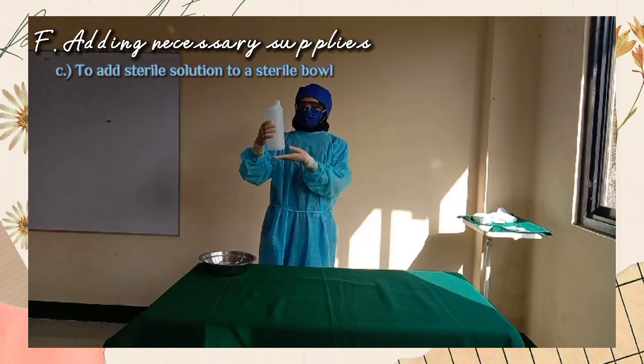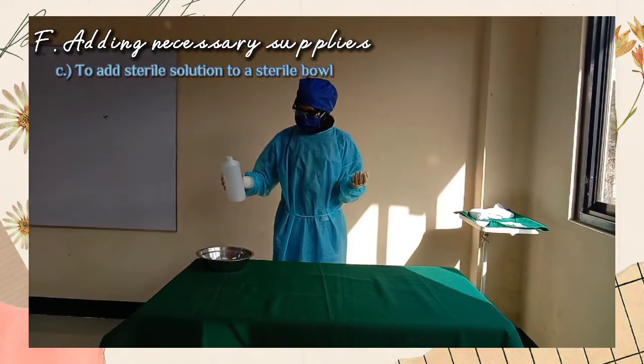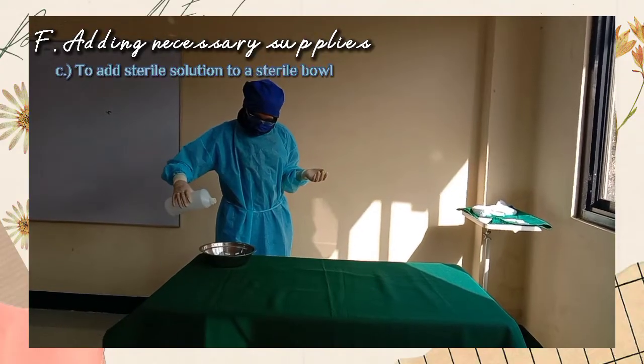If the bottle had been previously opened, pour a small amount of liquid into a waste receptacle without letting the tip of the bottle touch the receptacle. Carefully pour the solution into a sterile container in the sterile field so as not to splash the liquid. Any moisture will contaminate the field.